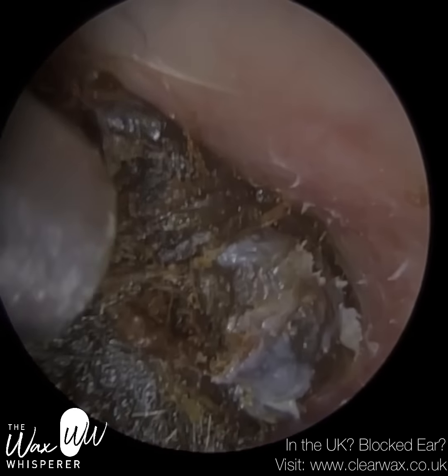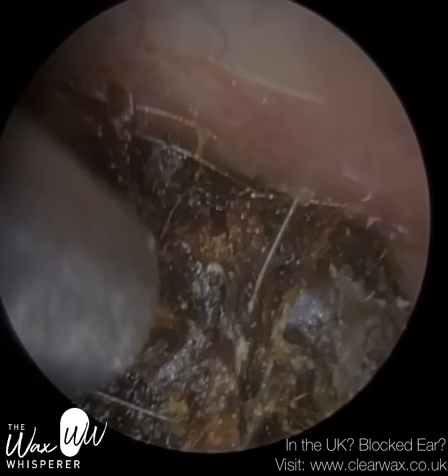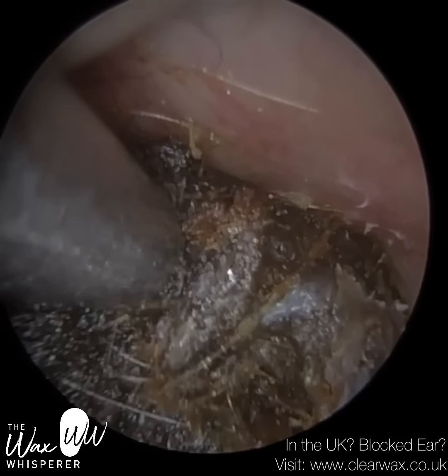The earwax has been there for a while. You can see the colour is quite dark, so it's oxidised — it's matured earwax. When earwax is freshly secreted, it's more of an orangey colour.